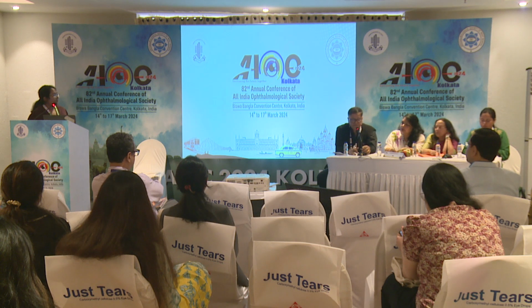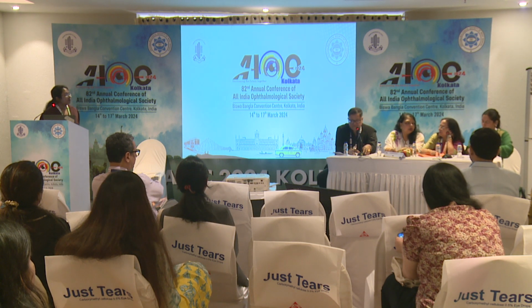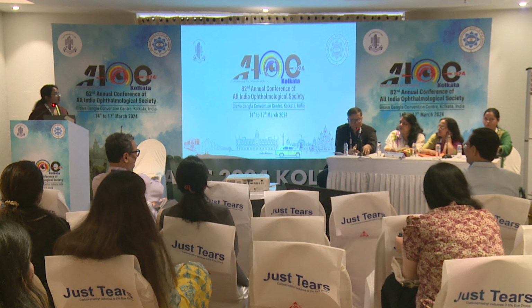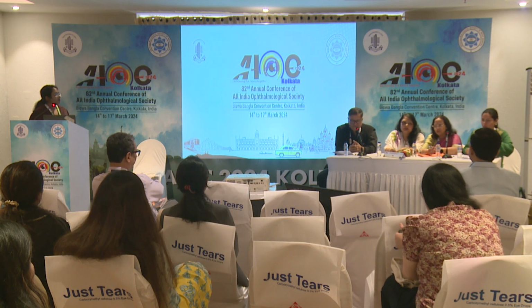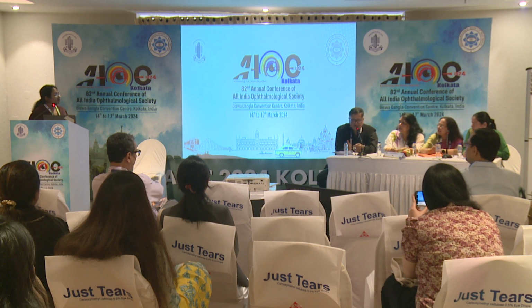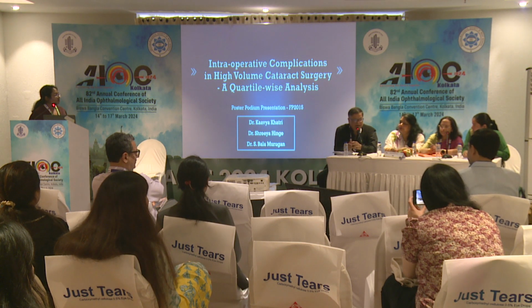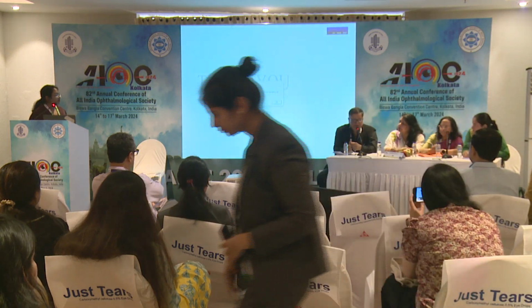For soft cataract, do you need all this difficult instrumentation? Because that is going to increase the chance of complications more, no? What is your opinion? Intralenticular manipulations, when you can do a very nice aspiration of the center and then tuck the nucleus so nicely in a single flip.